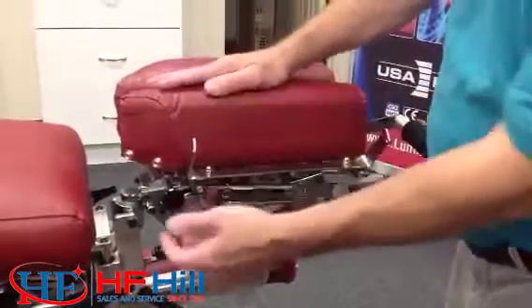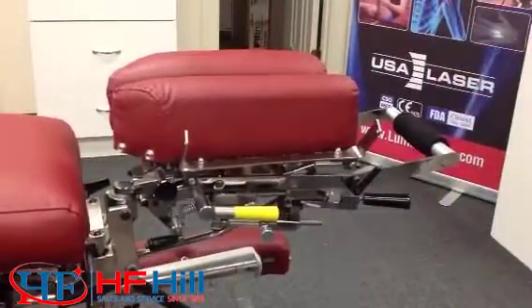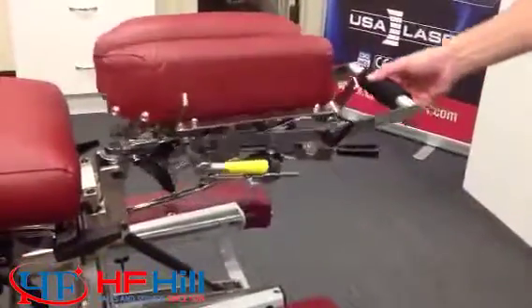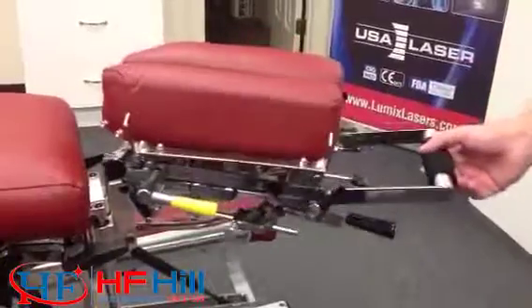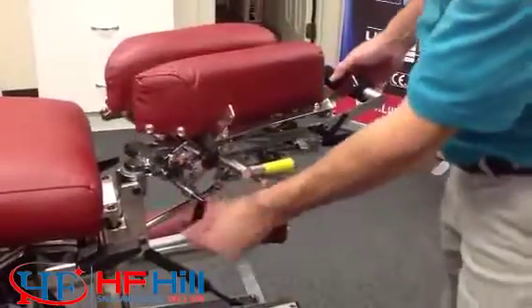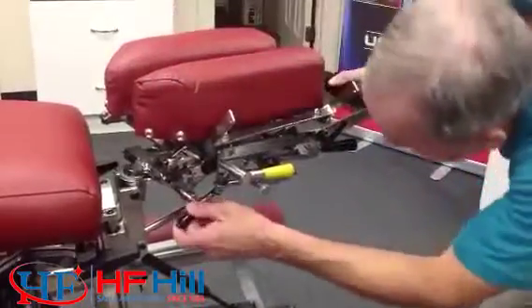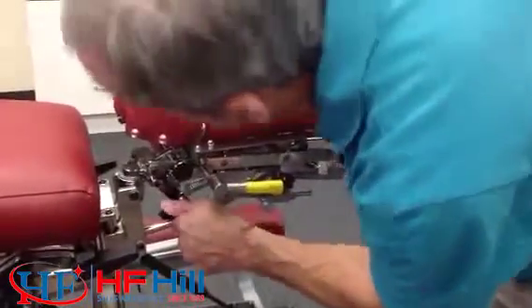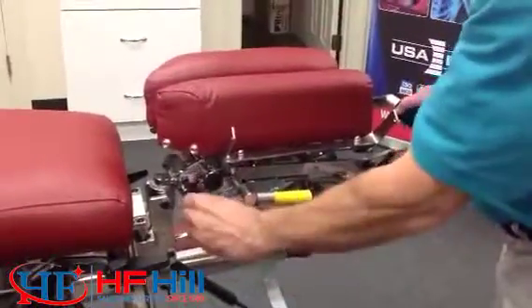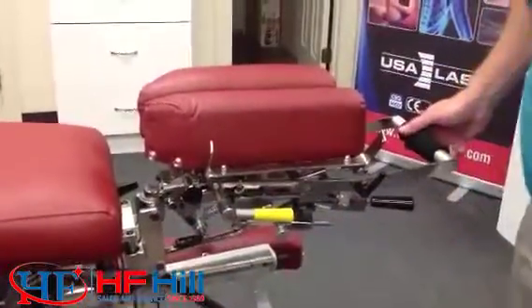Okay? So we do this adjustment here when the headpiece is in the down position. Alright? This knob down here below is a lateral flexion release. So we have a very nice range of lateral flexion in this headpiece, and you can lock it in at any position. Let's see, where's our lock? There's our lock right there. Lock it in at any position and do your drops, and you unlock it and you put it back in. So that's our lateral flexion lock.